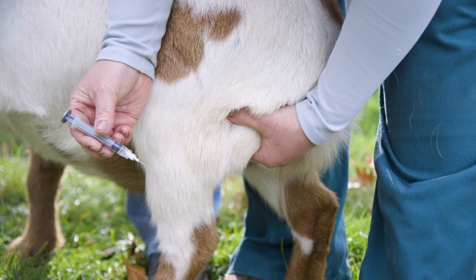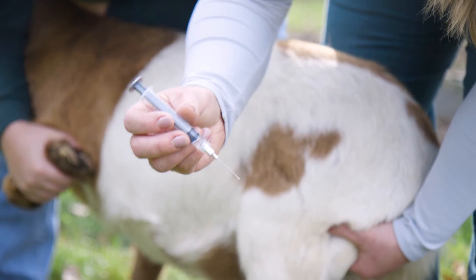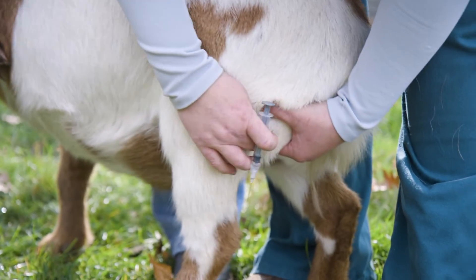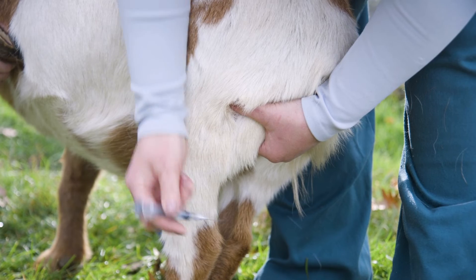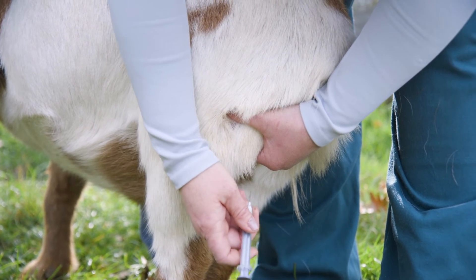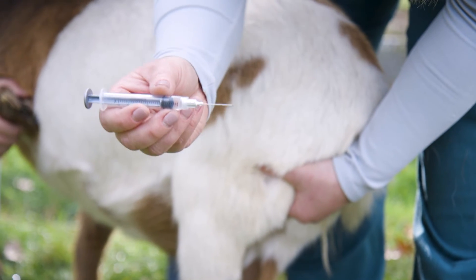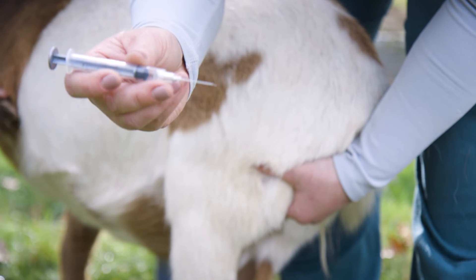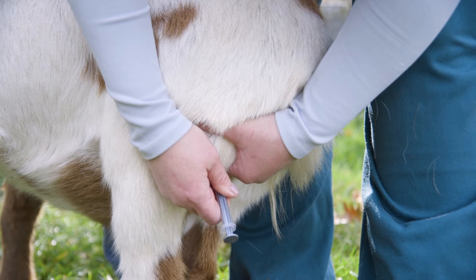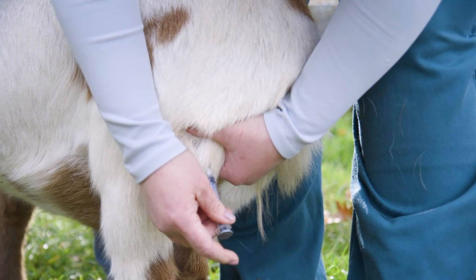Just as with any injection, you want to make sure the point of your needle is going into the goat, with the bevel up — facing towards you. Instead of going parallel, you're going to go perpendicular into the goat. In his case this is a one inch needle. You don't need to go the full length — going about halfway or half an inch would be sufficient. So you go in like any injection, pull back, and then give your medication.